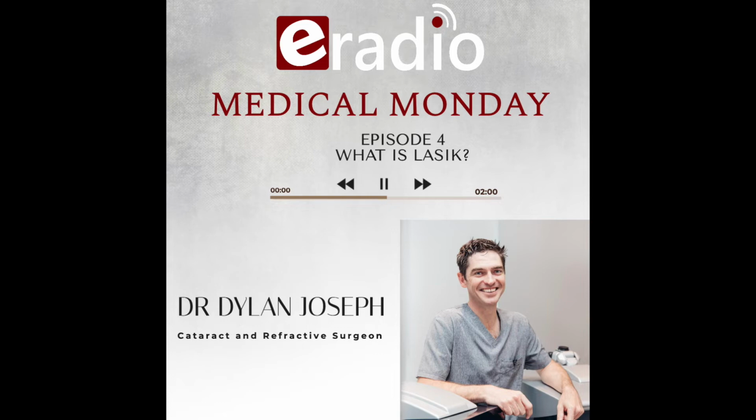And secondly is the visual recovery that's involved in PRK. Traditionally, it's not a practice builder, so to speak, because it's uncomfortable and because it takes 5 to 6 weeks for your vision to stabilize. But when you look at PRK versus LASIK at 3 and 6 months, the results are exactly the same.